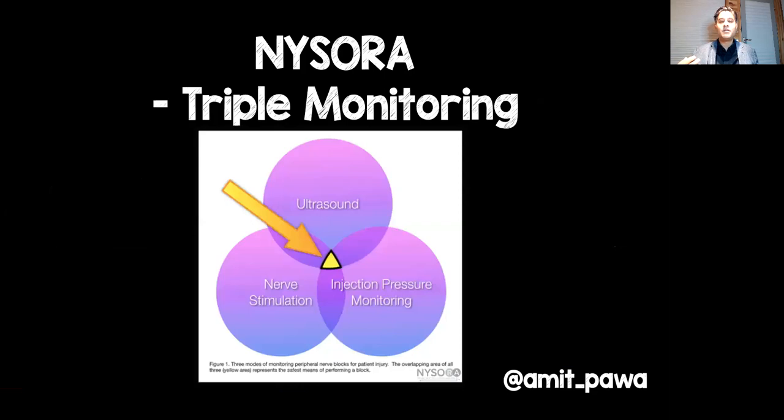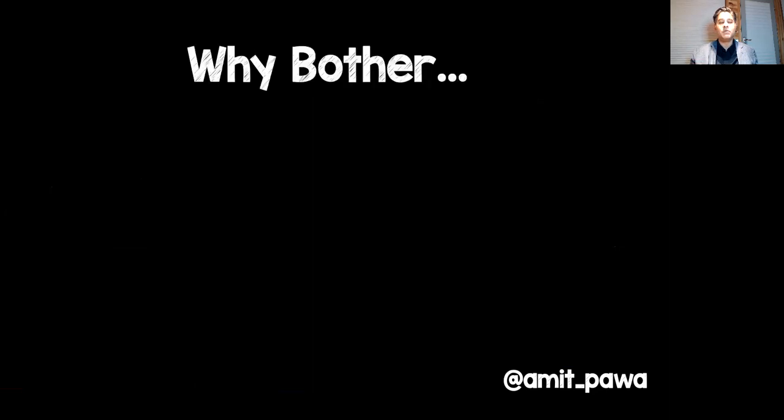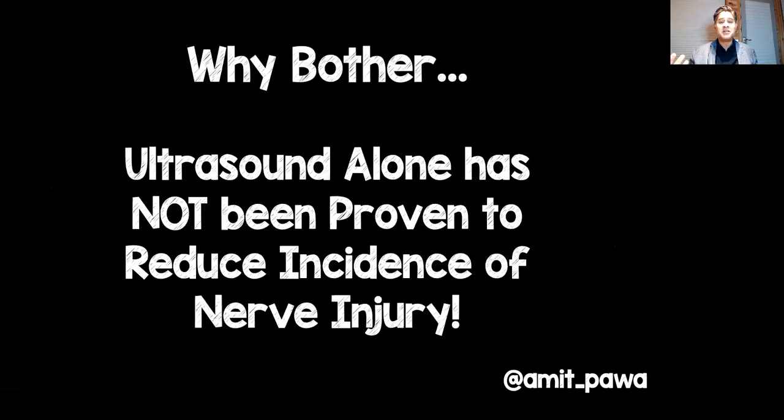Now, this is something that NYSORA had been talking about for a while, using those three different modalities to make your regional anesthesia as safe as possible. But why bother? Well, the truth is, unfortunately, ultrasound alone has not been proven to reduce the incidence of nerve injury, and we're probably never going to see those papers for a whole multitude of reasons. That's a lecture in itself.